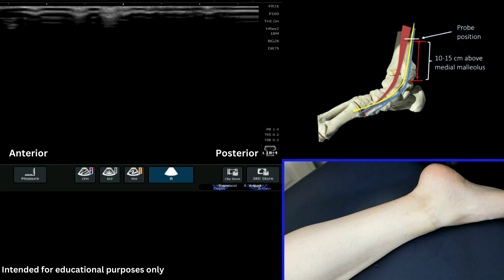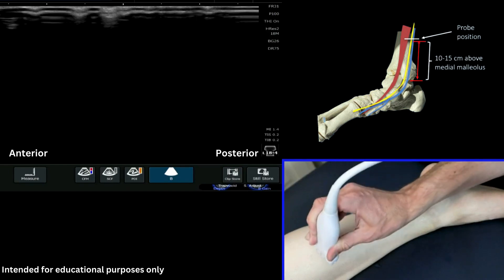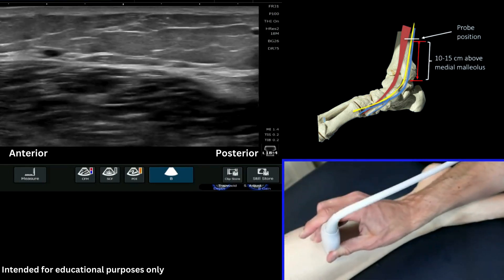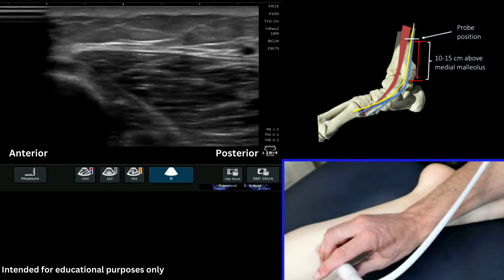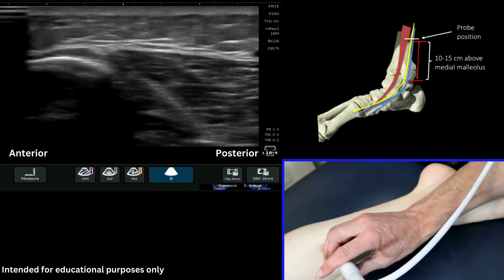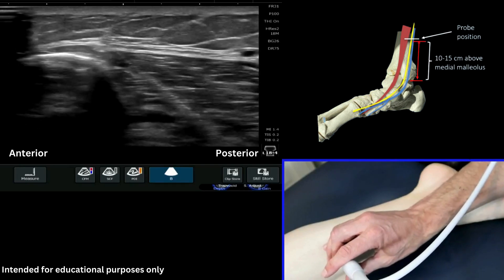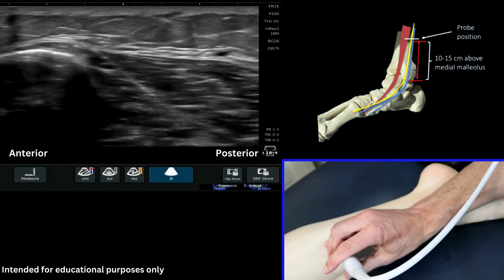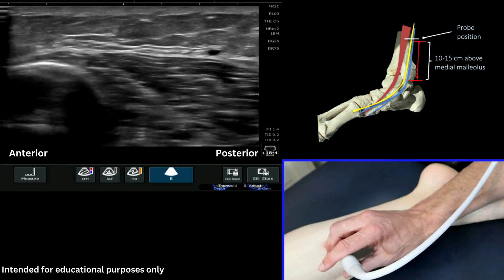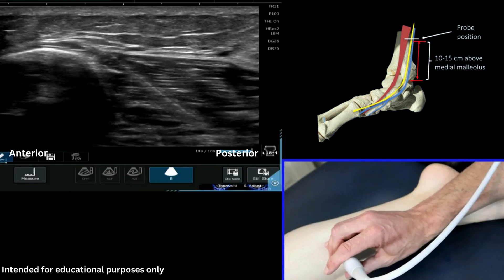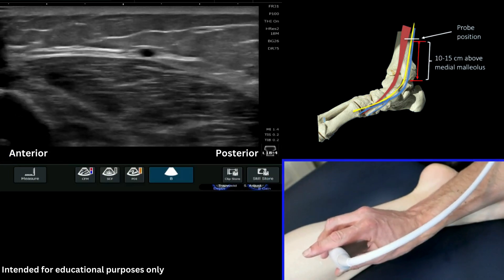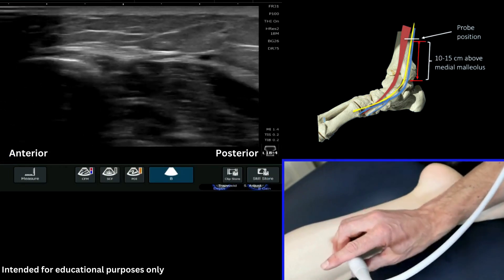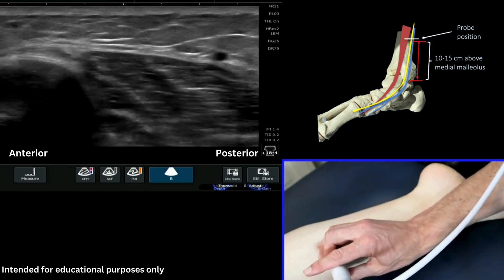The key thing with this is that the saphenous nerve always sits with the saphenous vein, and so that's what you're looking for. Pop your probe on in this sort of position — best have the patient in slight sideline — and what I would suggest you do to start with is just find that medial or anteromedial aspect, the border of the tibia, so we can see the nice bright white bone of the tibia here. Skeletal landmarks are always very useful in these instances to identify first.